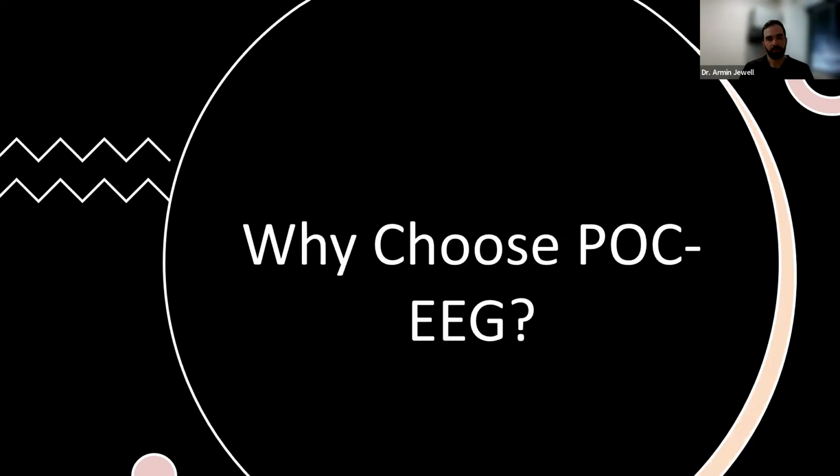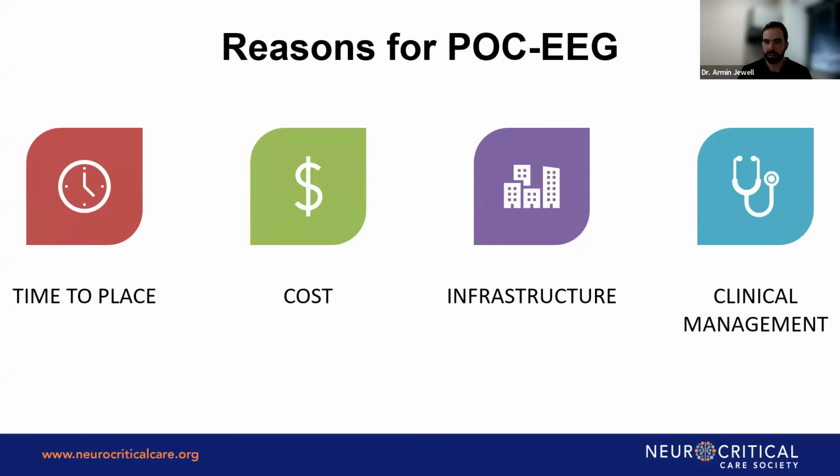So we're going to go through point of care EEG now. So why should we choose point of care EEG? What's the reason for it? What is the process that says, hey, I wanted to choose a point of care EEG over a standard conventional EEG? So some of the similar reasons that we talked about as limitations for the conventional EEG are the reasons for point of care EEG.